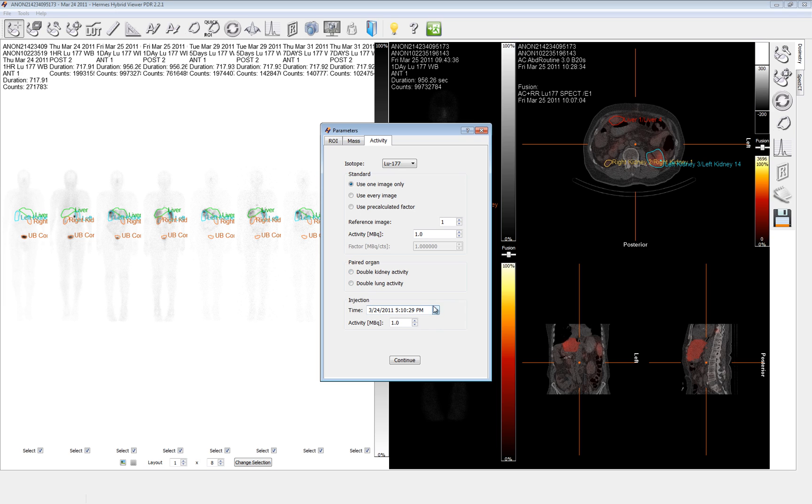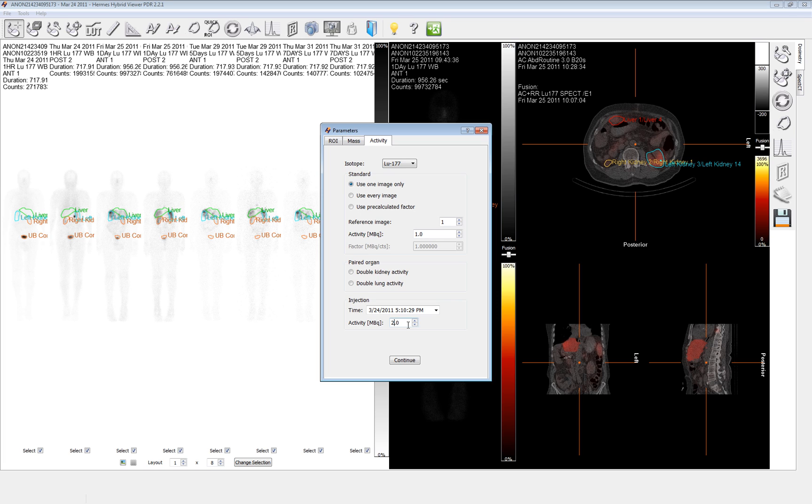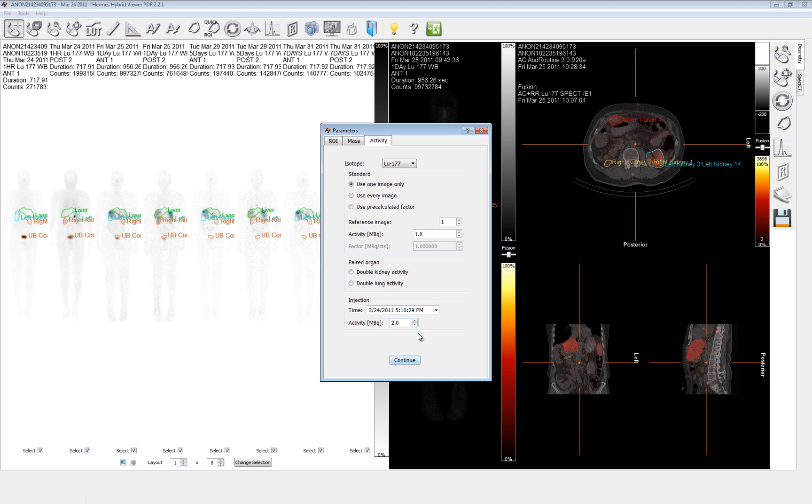The injection time was read from the header here and seems to be accurate. The activity we can change to whatever, we'll call it two in this case. This is a little bit less important because on the last page one of the things that we'll have is the dose per megabecquerel, but then there will be another page where we do this scaled by the amount that we've injected to. And that dose per megabecquerel will allow us to expect for a treatment dose what to get for each organ by a multiplicative factor for each value.